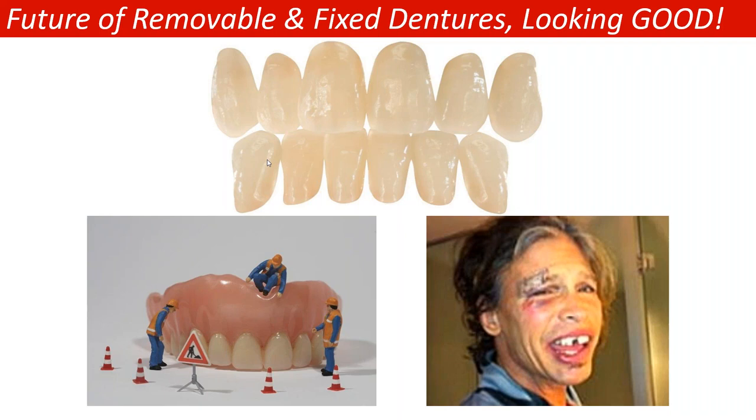Those of us that have been in the business for a long time, and Aaron, you probably have as well, know that it all comes down to how we set those teeth up. If they were snapping for an individual patient, then that occlusion is probably off and you have interference, right? Especially with anterior teeth, the patients are extruding as they're talking, coming across the face and bumping up to each other. And with enough force, especially on implants, those edges can snap. They're not made out of steel. They're made out of a ceramic polymer, if you will, to make it look like a natural tooth.